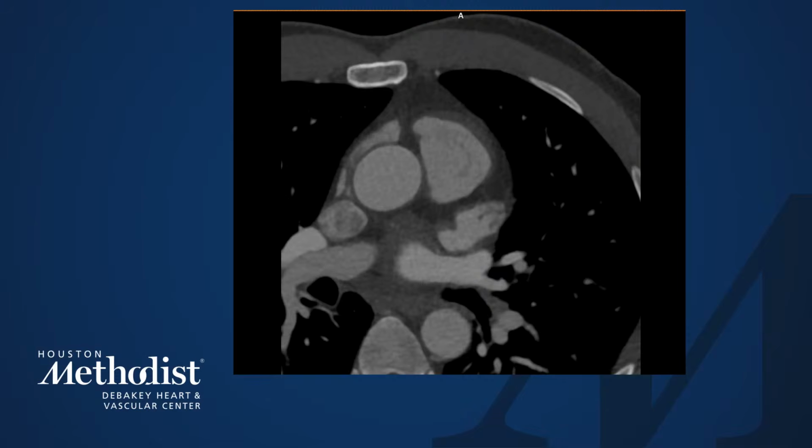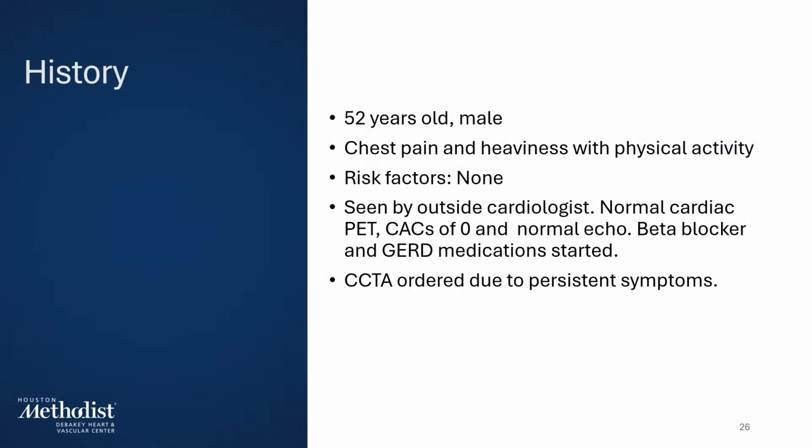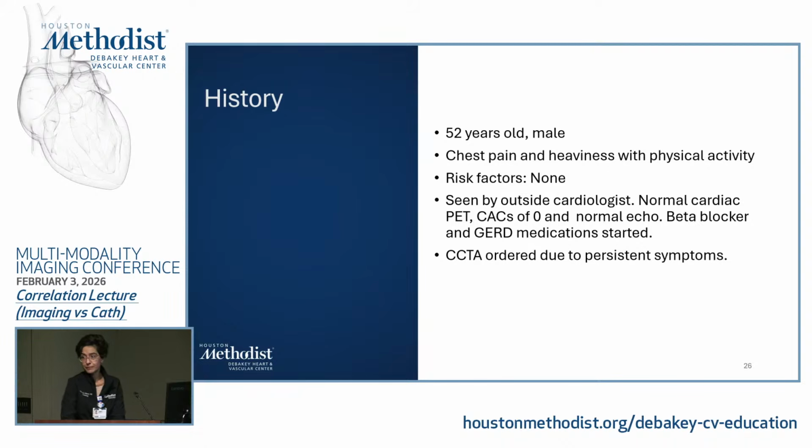You know, the outside PET, did they do perfusion only, or did they also add flows? Only perfusion, I believe.